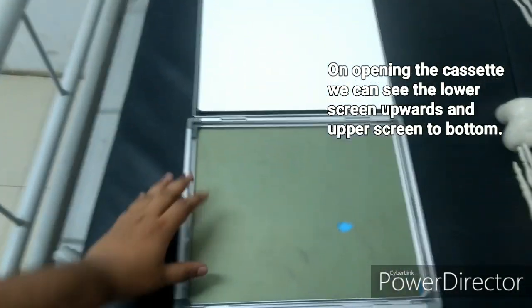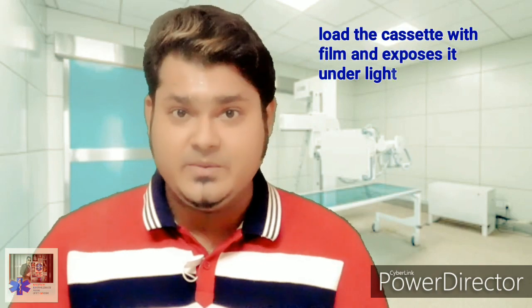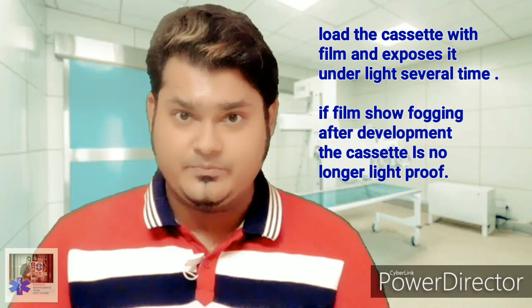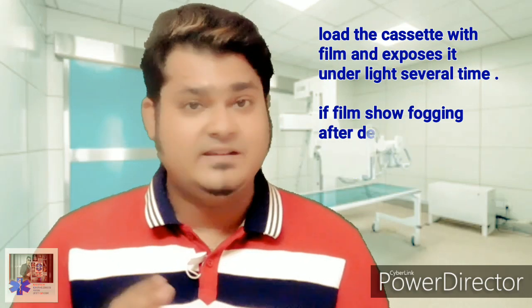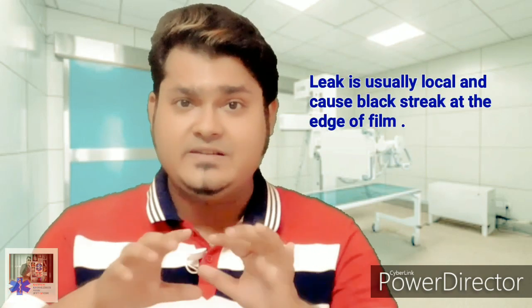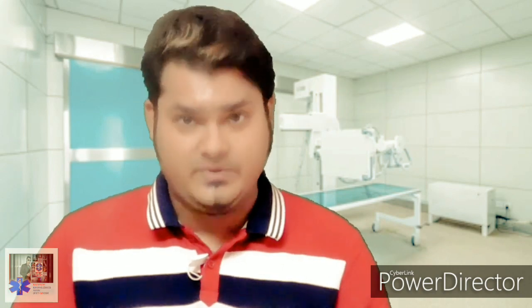To check the light tightness of the cassette, one can load the cassette with a film and expose it to intense light for a period of time. If the film shows fogging after development, then the cassette is not light-tight. The leak is usually local and produces black streaks at the edges of the x-ray film.